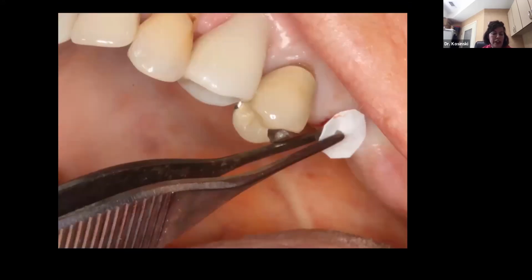Now I can feel here that I did not perforate the sinus floor, but if you happen to do that, it is not overly concerning. However, if you do perforate, do so with the smallest diameter burr or osteotome. Subsequent preparation should thus be made shorter.